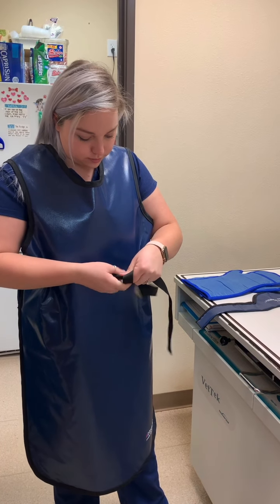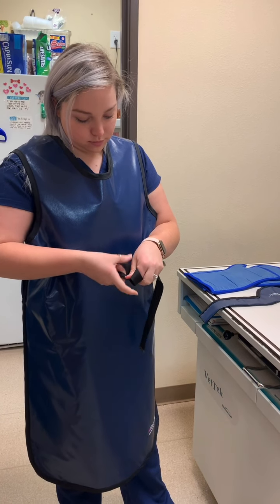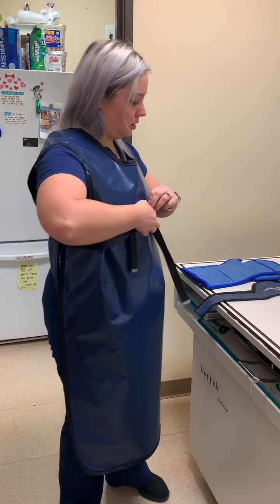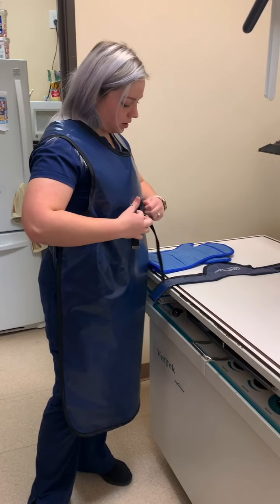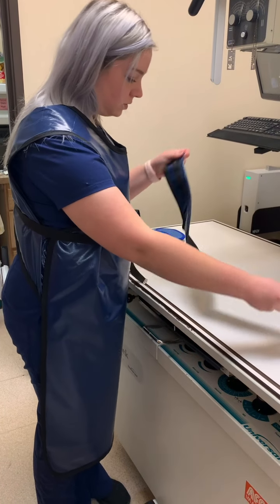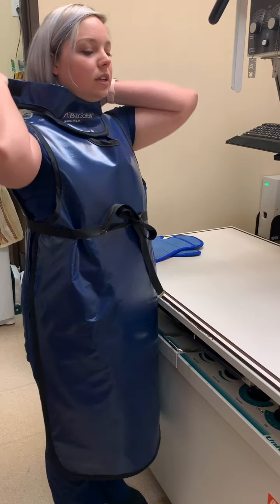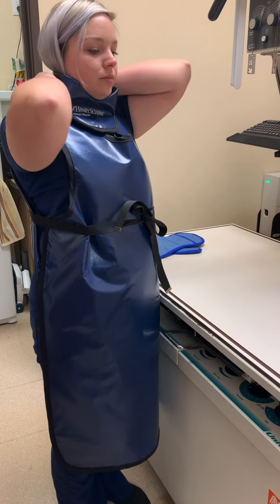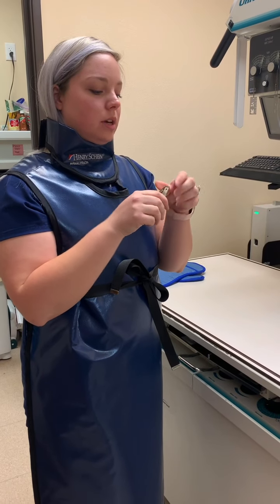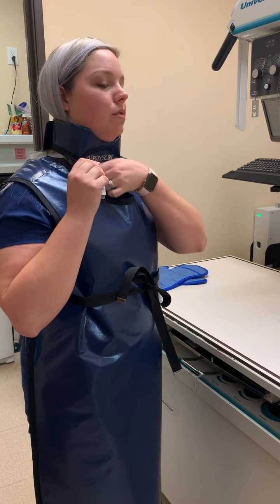And tie it. And then we have our thyroid shield, and it goes around the neck. Dosimeter badge that is going to be clipped to the thyroid collar at thyroid level.